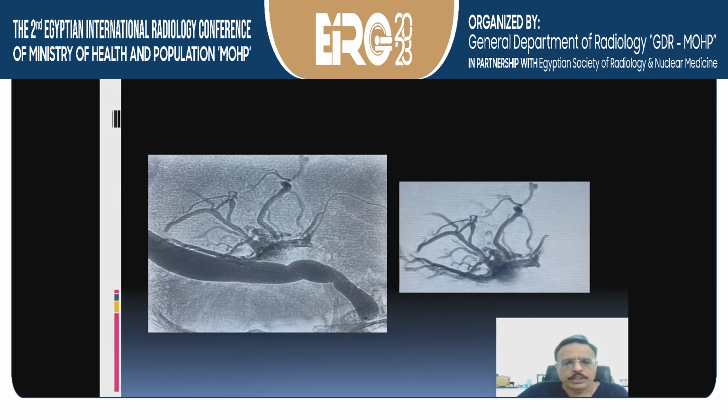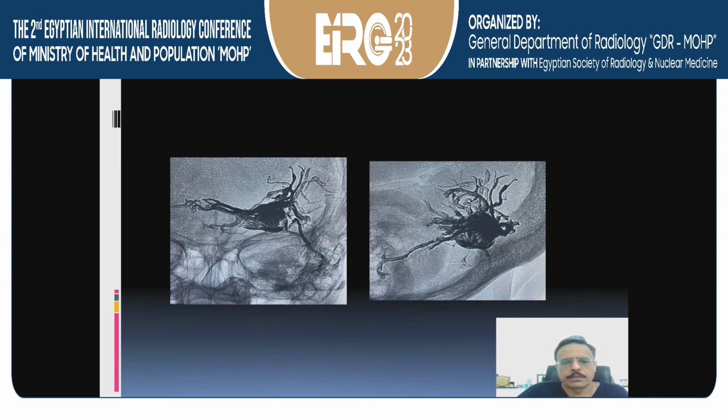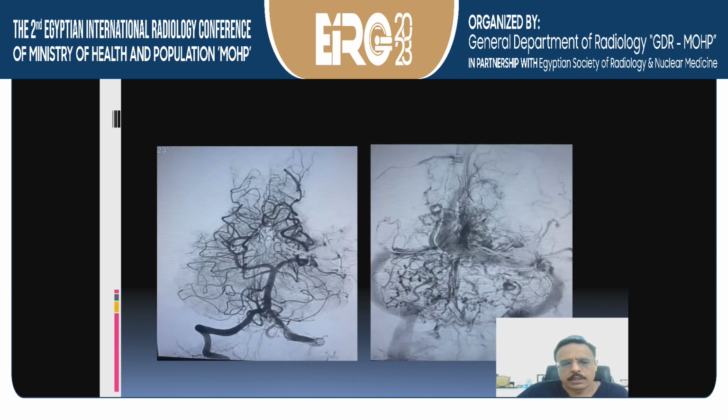And then when we do the injection, what we can see is the dye is not going into the sinus, but is refluxing to all the feeders. Now we have very good flow control, and we could do very aggressive and quick injection to get a complete cure. The final angiogram shows the fistula completely gone, and this is the final Onyx cast. But one can see we have left a passage for the sinus within. And you can see in the lateral view also, down the barrel view, the sinus was spared.